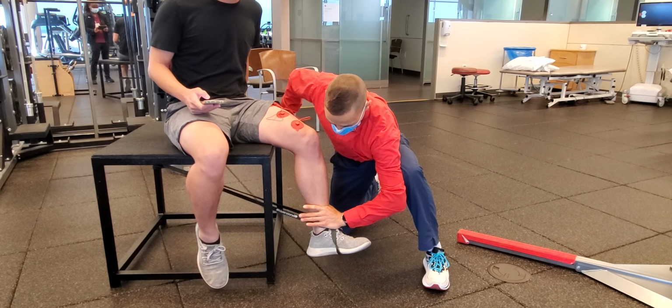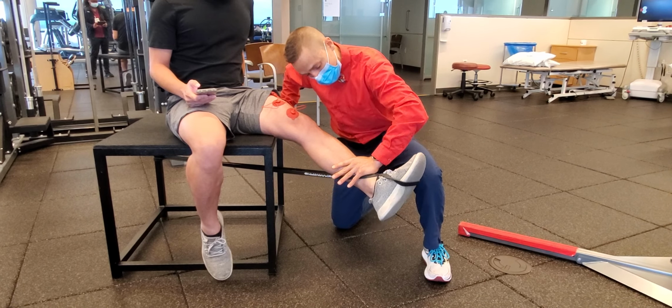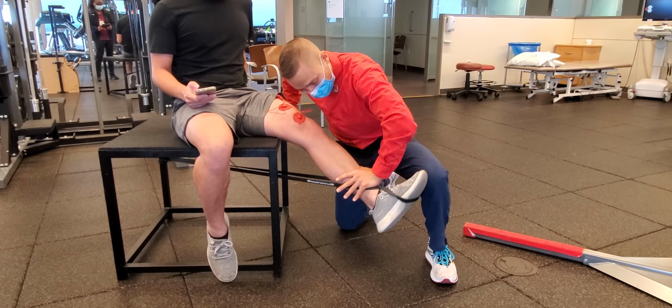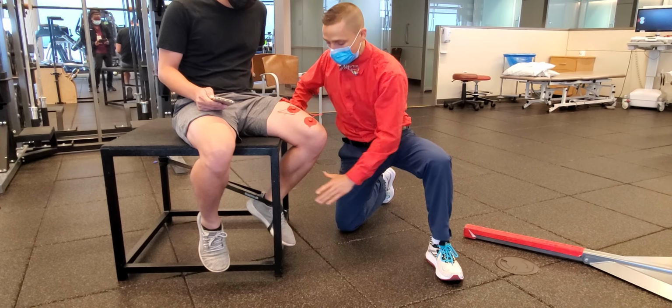Great. And you're going to have the stim as high as you can. Push all the way up, all the way up, all the way up. Get the terminal as hard as you can. There. And then hold strong. Don't let me win. That's all right. Yep. Ready? Great. And then again.